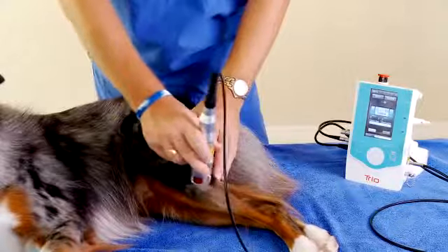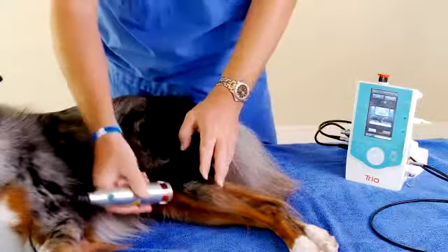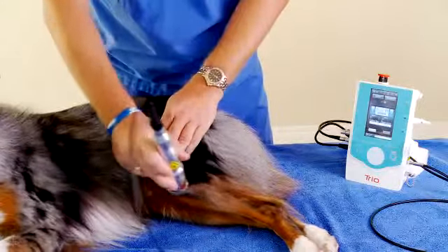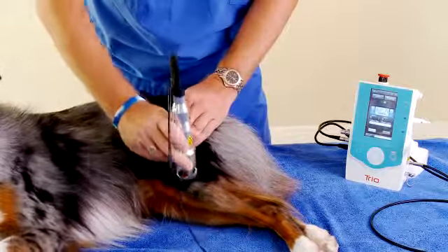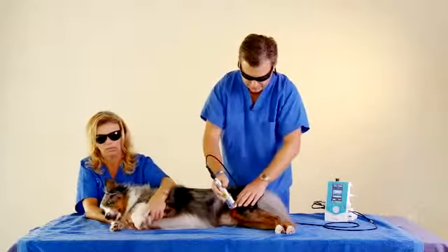If you've got a long hair patient, you can bring the fur back as you treat in a painting motion. You want to start with the main area of the injury first. Some techniques you may have seen where they wet the dog down. You can do that if you'd like. You don't necessarily have to.